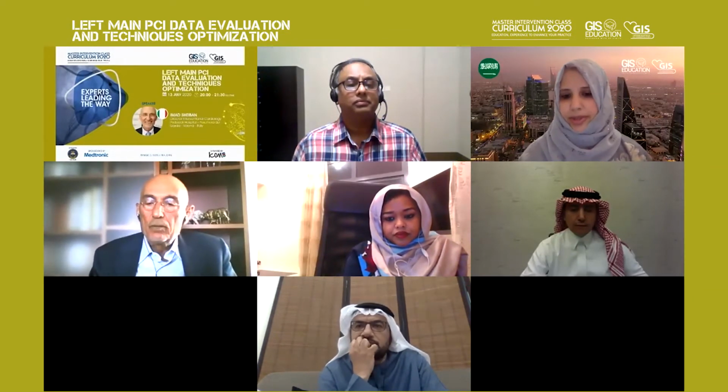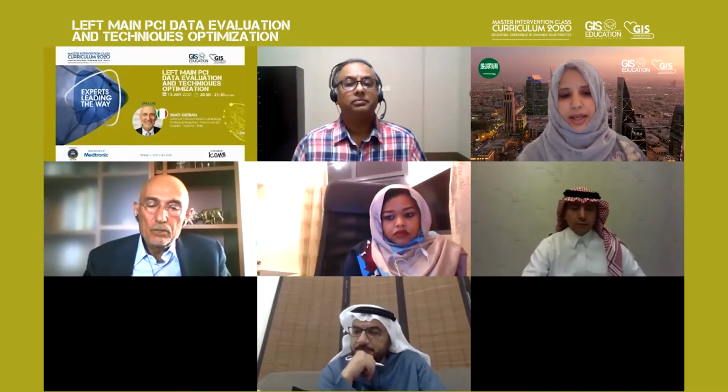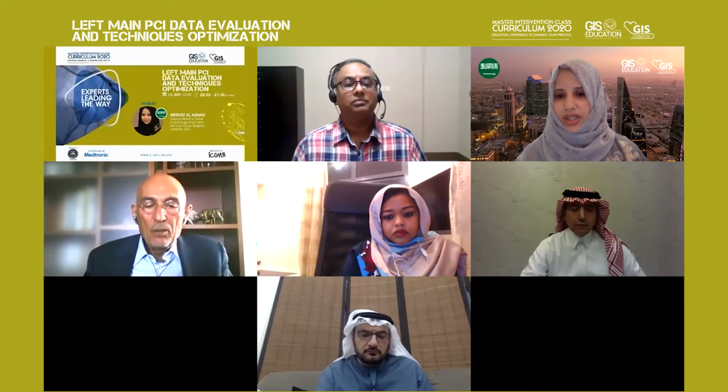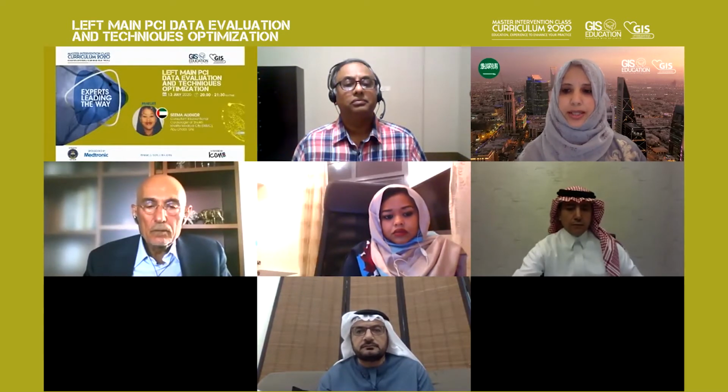So thank you, Dr. Imad. It's a very thorough presentation. From a practical point of view, there are several points that I'd like to mention. I know the bulk of the studies that were published and that we based guidelines on in our practice actually depend on the syntax score, but unfortunately the syntax score is an anatomic score.